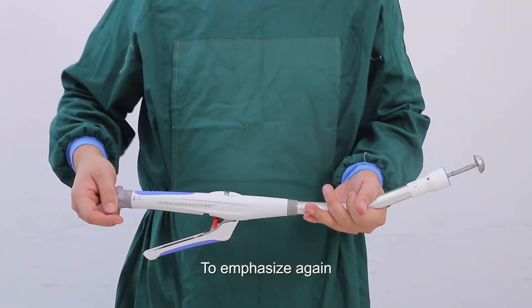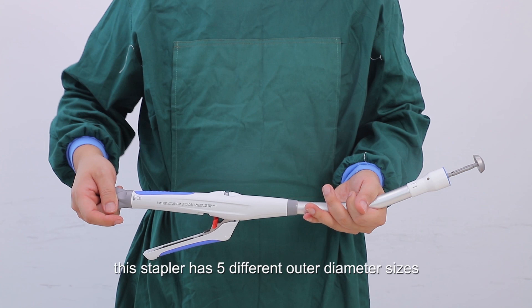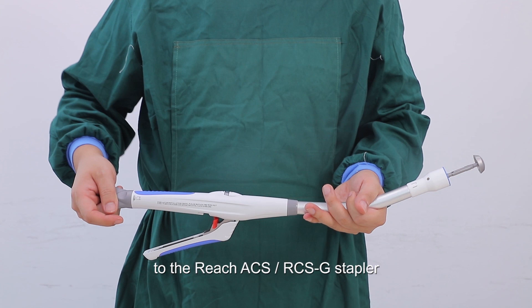To emphasize: this device is for single use in one patient only. This stapler is available in five outer diameter sizes — 21mm, 25mm, 28mm, 31mm, and 34mm. This concludes the introduction to the Reach ACS RCSG stapler. Thank you very much.